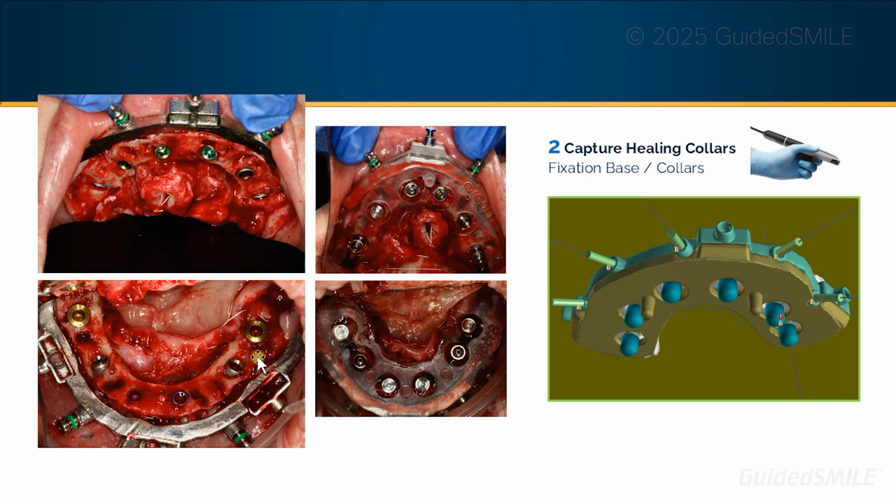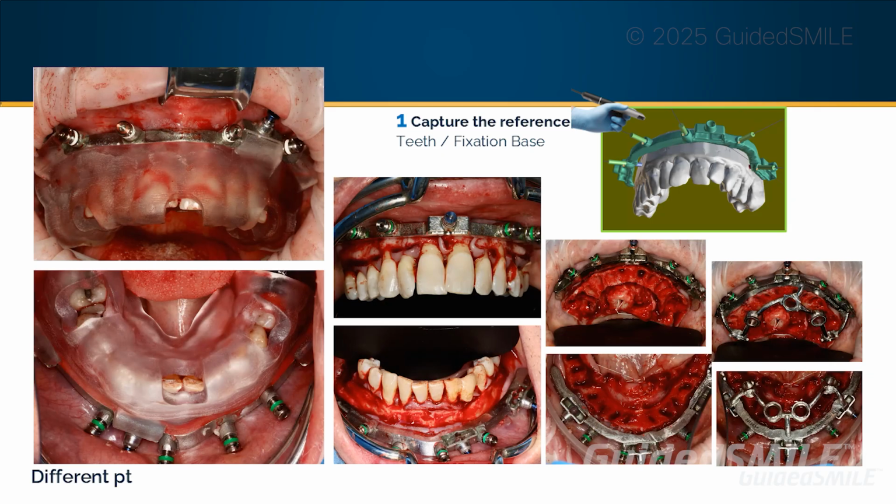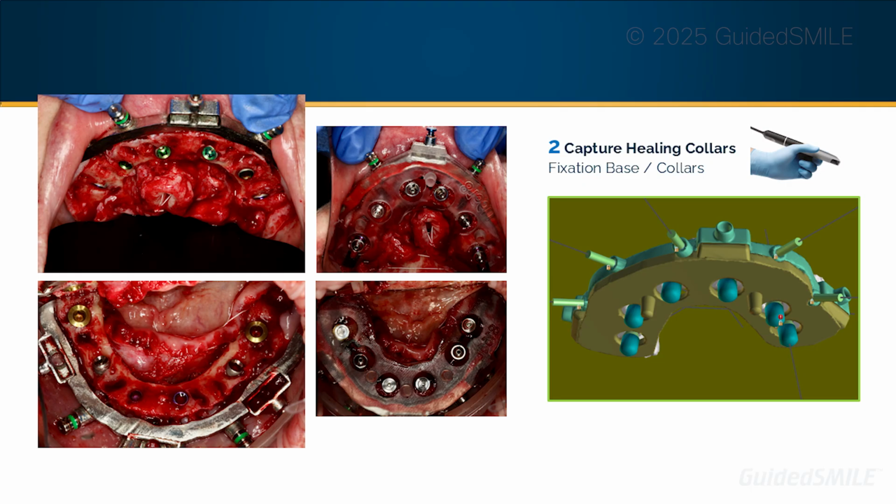Then the implants are placed, and then you'll place the carrier guide, and it'll be a monochromatic carrier guide, not surgical resin. It'll be monochromatic like this. This is scan number two. So again, scan the fixation base because that's your breadcrumb, and put the carrier guide on or off. This is not required, depending on what scanner you have and how easy it is to scan. And then you'll traverse over to the healing collars, okay? And that means that the fixation base has preserved the bite, and then the healing collars are what we match up with the photogrammetry. So that's scan one, fixation base, scan two, fixation base and healing collars.